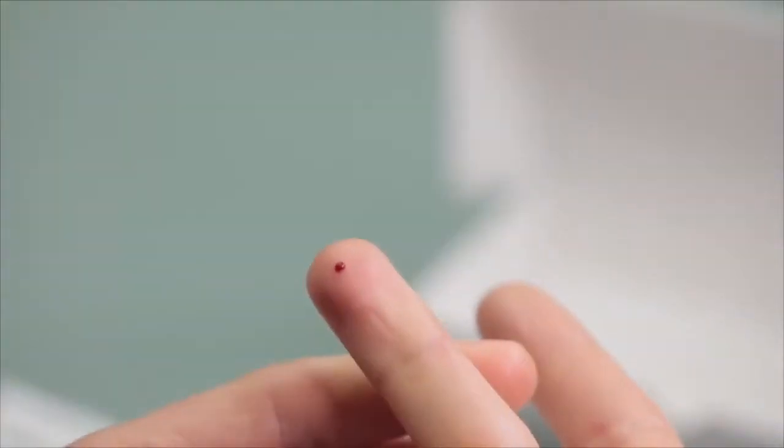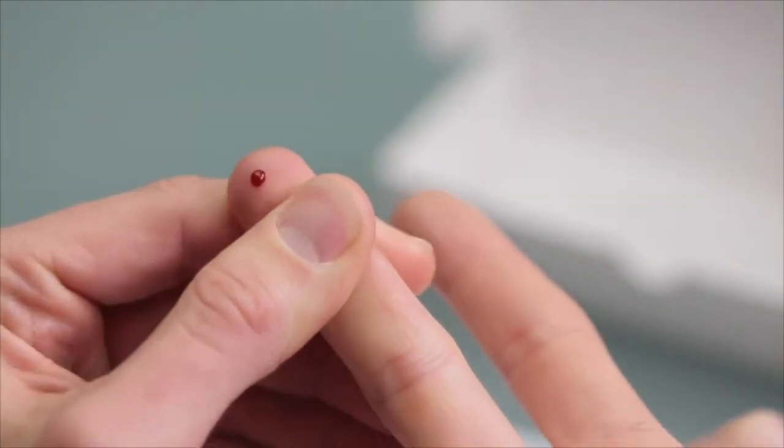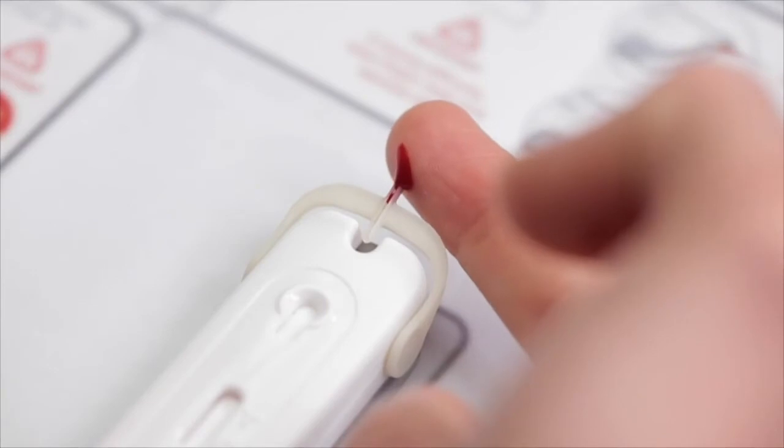If the tube is not full, squeeze your finger again behind the prick site. Now touch the blood to the tip of the tube to continue filling.